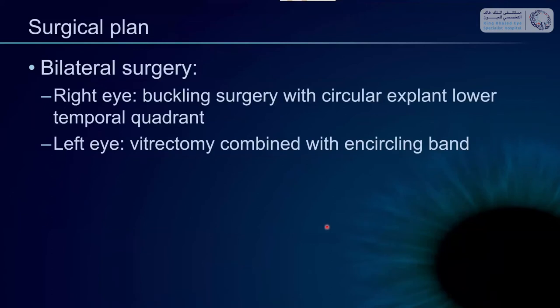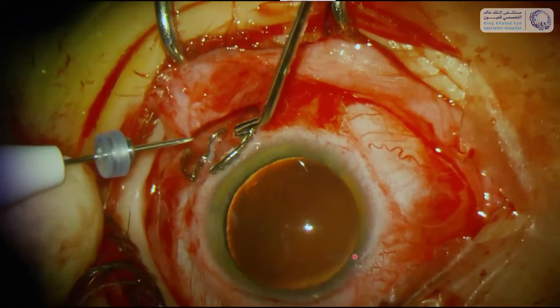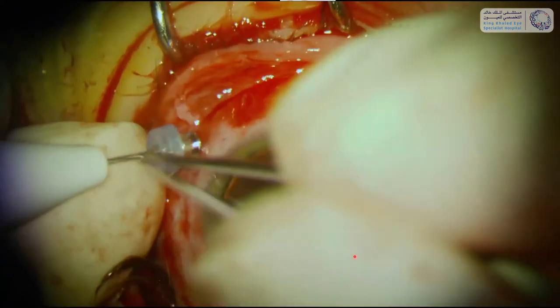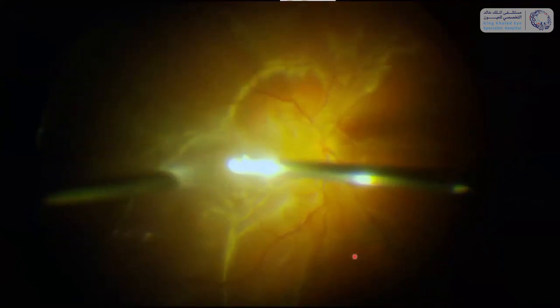We decided to do bilateral surgery — an external buckling surgery with a circular buckle in his right eye for the most acute detachment, and in the left eye with the long-standing detachment I performed a vitrectomy combined with an encircling band under the same anesthesia. I wanted to show you the surgery in the left eye with the subretinal PVR. The encircling band is already placed around the eye and this is the installation of the infusion cannula. I always work hybrid, meaning the infusion cannula is 27 gauge and the working cannulas are either 23 or 27 gauge.